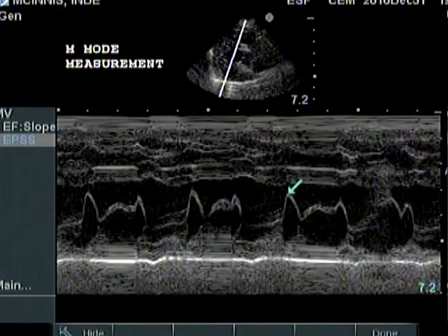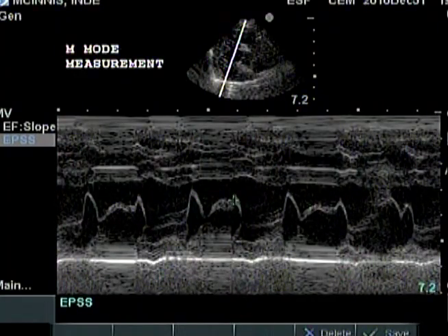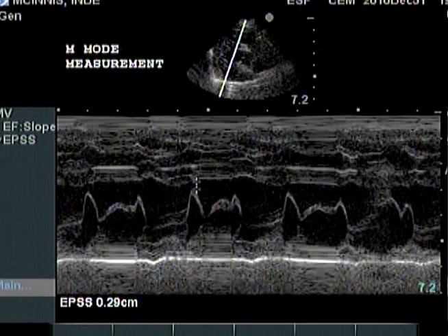touching the septum. Place one caliper at the point of the E wave and the other at the septum directly above the E point. Note that I used the left side of the horizontal bar of the calipers to make measurements. Save the measurement to the patient record.